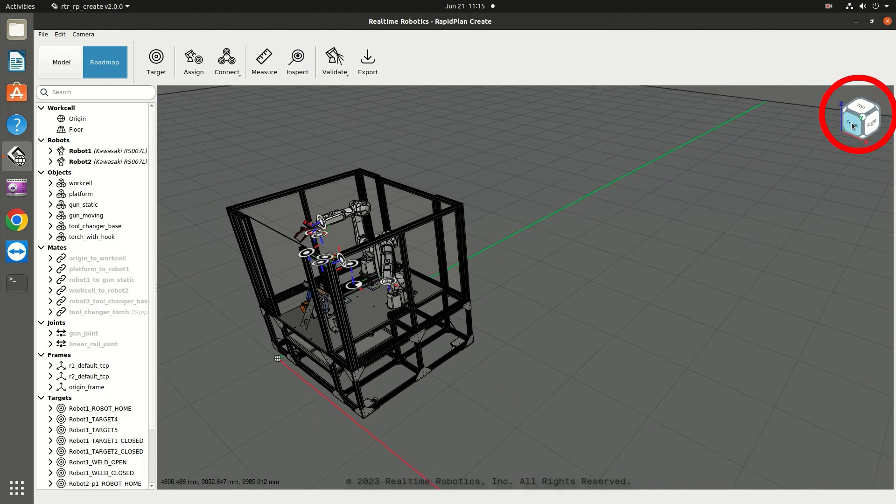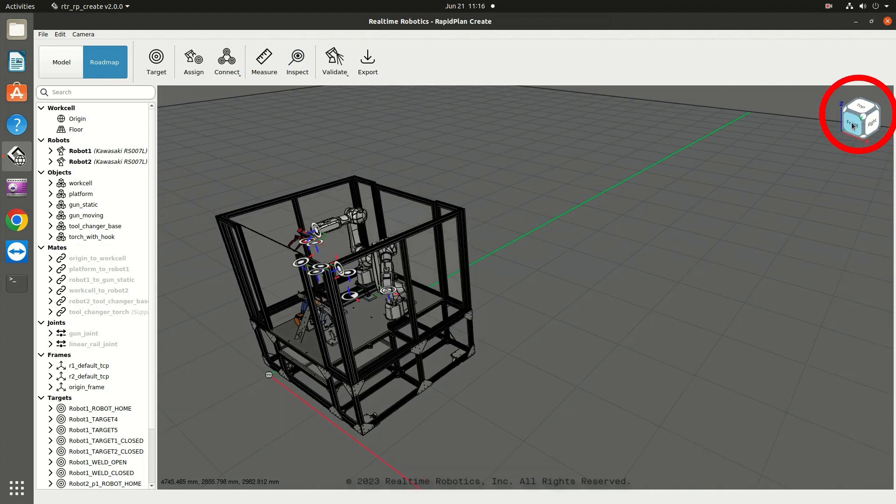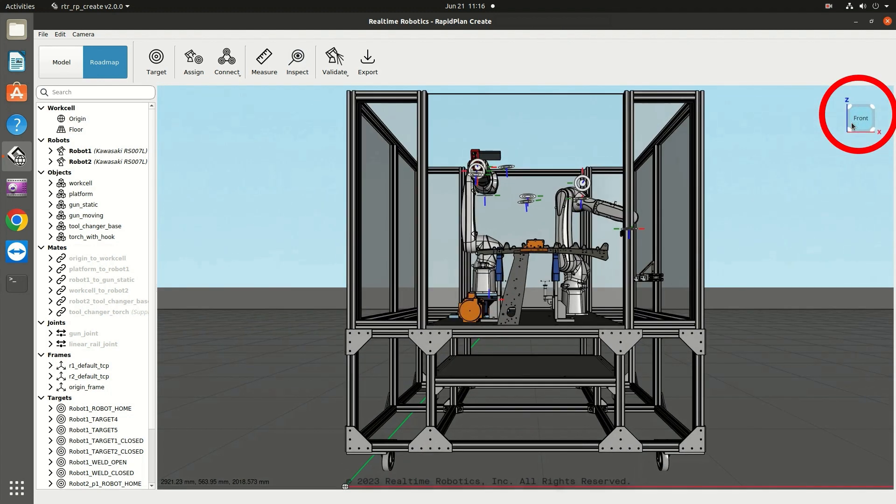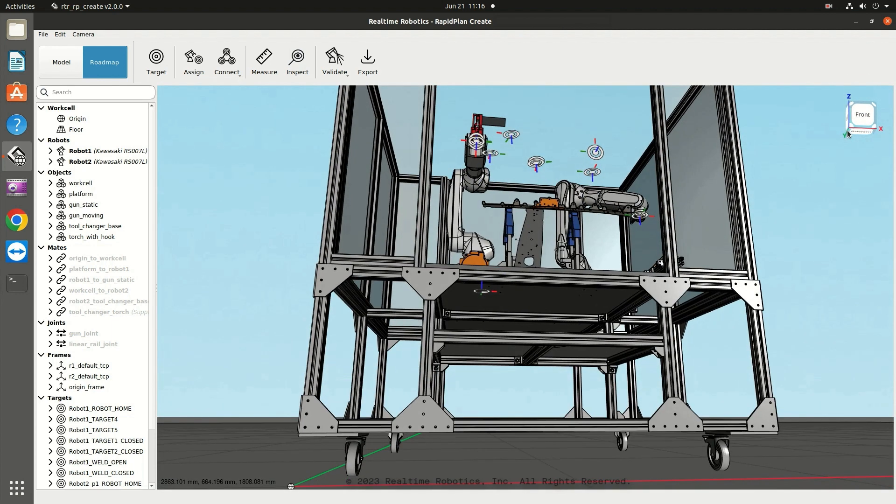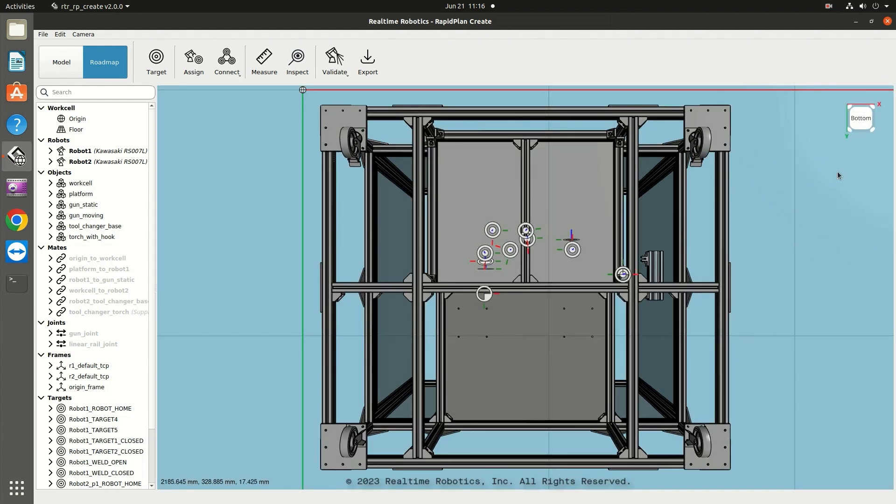Use the orientation cube in the upper right corner of the window to snap to various views of the work cell. Just click on the desired view. Note that how the cell has been created in RapidPlan determines which views are labeled as front and back, left and right, and so on.